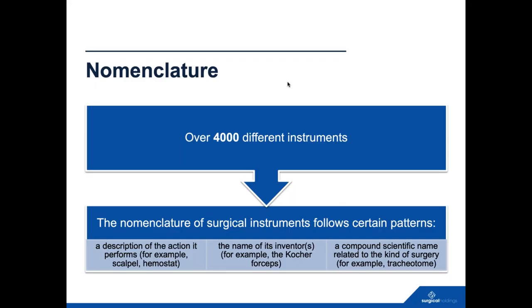Yeah, very much so. Same thing, and I often remind folks of the challenges that the CSSD technicians face when they're assembling these trays. There are 4,000 different patterns here. Some manufacturers have over 5,000 patterns, and these technicians are expected to know how they work, the name of them, and how to clean them properly. So it's really a challenging task, and truly the best way for them to identify the instruments is by the marking on the instrument with the number rather than applying additional tape.